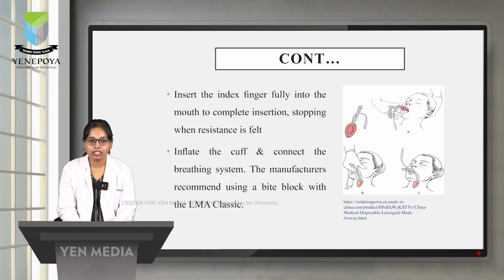Insert the index finger fully into the mouth. To complete insertion, stop when resistance is felt. Inflate the cuff and connect the breathing system. The manufacturer recommends using a bite block with LMA Classic.